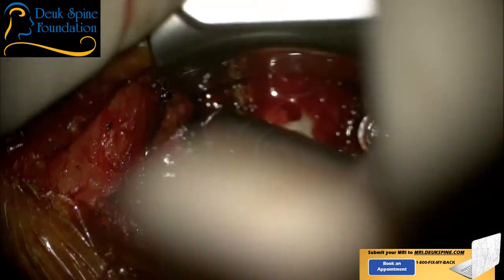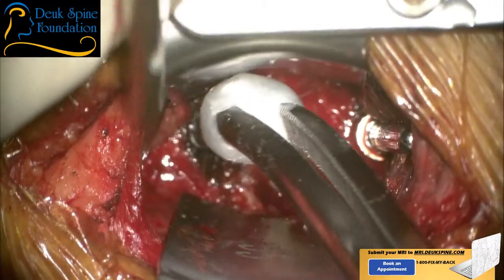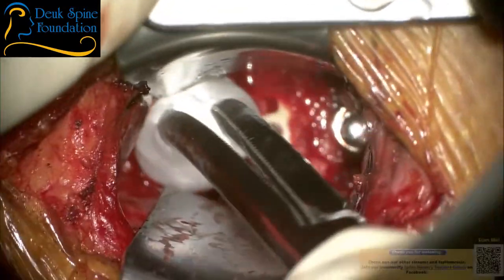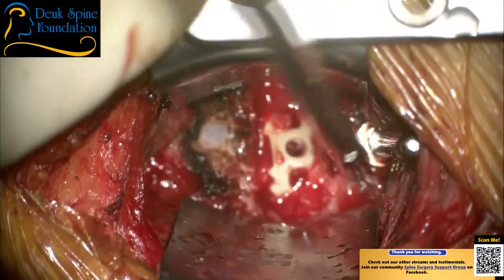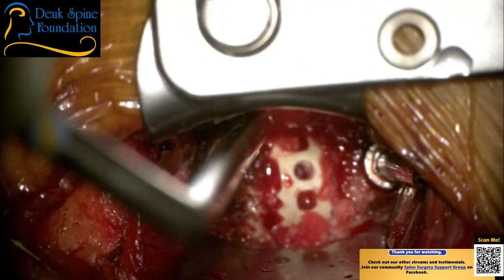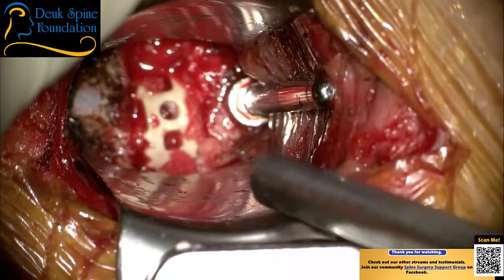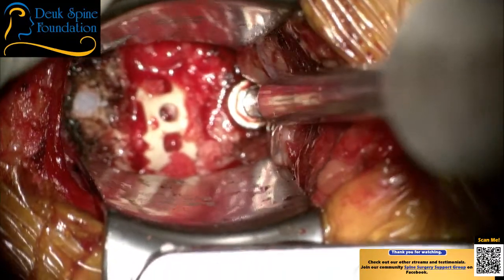Bone wax on a stick. Ready. So we're going to plug these little holes with bone wax, which we stole that idea from dentists. Watch your eyes. But it's used in surgery. Bone wax is used by orthopedics and neurosurgeons.